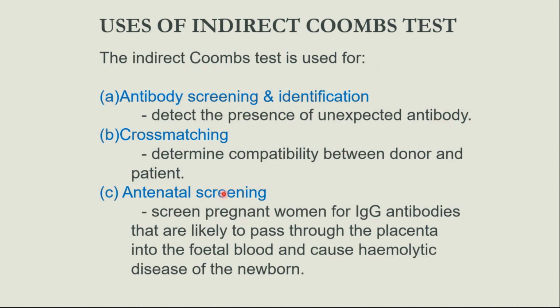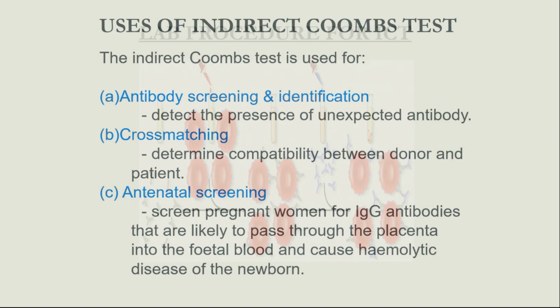Next is cross matching to determine compatibility between donor and patient. Next is antenatal screening. Screening pregnant women for IgG antibodies that are likely to pass through the placenta into the fetal blood and cause hemolytic disease of the newborn.